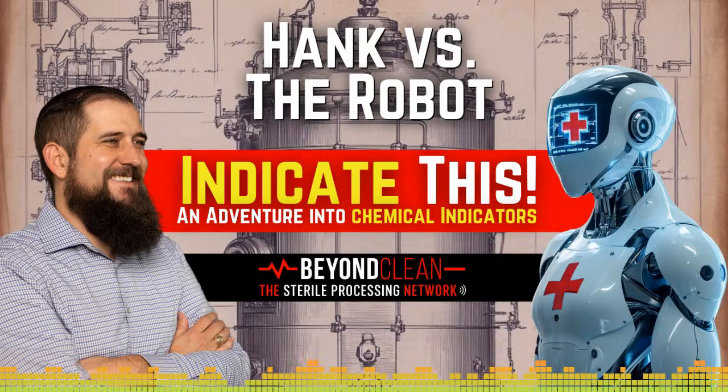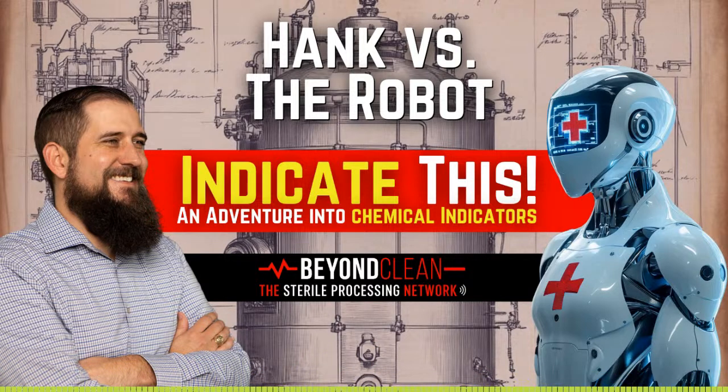Scenario 3, contamination or damage. If the chemical coating on an indicator or integrator is compromised due to moisture, handling, or even expired shelf life, it may not behave as intended. This can result in a false pass because the chemistry behind the reaction isn't functioning correctly. Scenario 4, misinterpretation. This is a human factor. If the change in the indicator or integrator isn't clear or the staff isn't trained to interpret it correctly, they might assume a pass when the conditions weren't met. For instance, an incomplete or faint color change might get overlooked.